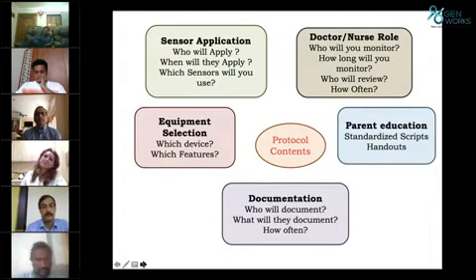If we have premature babies, then you don't need to monitor so long, and also it's not good for the baby. So usually you will monitor the first 72 hours, which is the main time when your IVH is going to happen. And then, depending on the baby's condition, you can go for weekly monitoring for 6 hours. And if any baby has seizures, then definitely until the time he is seizure free, that is the time you will be monitoring this baby.